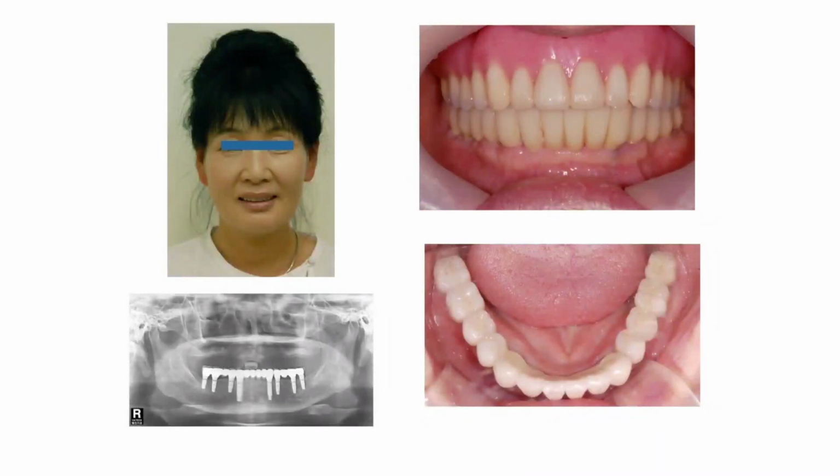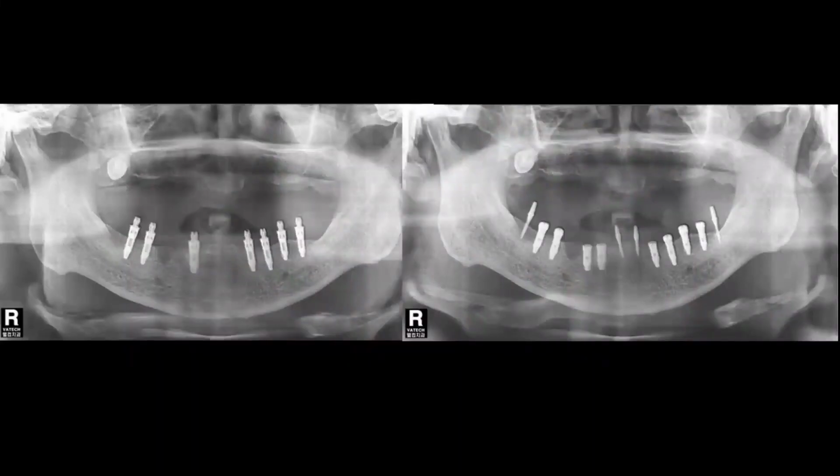Here's the photo after 5 years. Okay, let's see the next case. Immediate loading wasn't possible, so I used a temporary implant and did it this way.